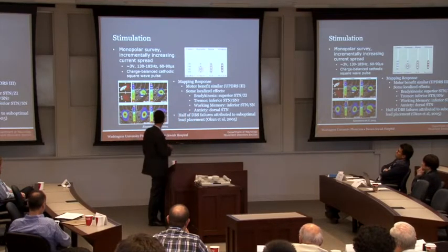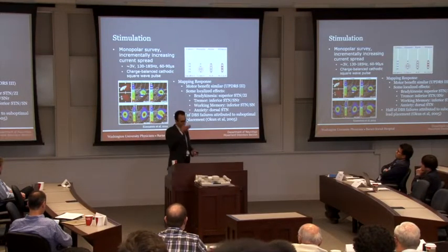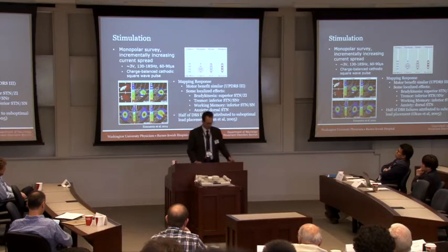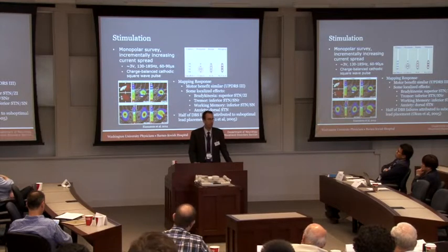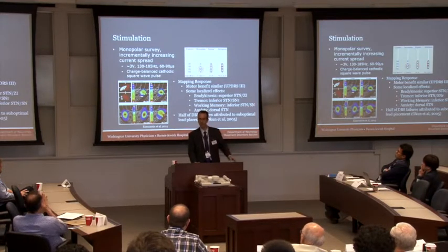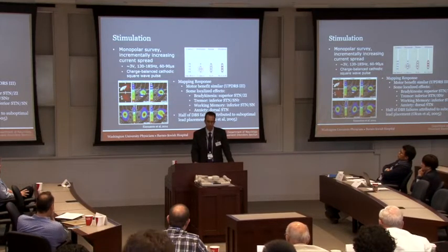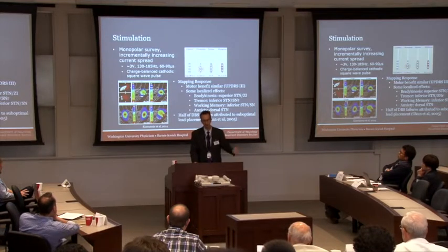I've placed this here. All this really is a map of the brain, slicing through the head like this, looking at it from this perspective. The concept I want to display here is that really, from a motor benefit, this target is forgiving. No matter where we stimulate within this target, there seems to be a significant motor benefit. So the UPDRS-3 is a scale that we use clinically to objectively, probably some subjective component to that, but measure response to DBS. And wherever we are in this target, that improves.